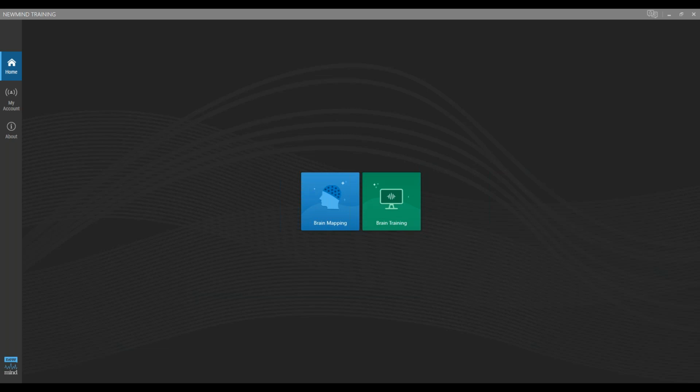Because I can't see that you're moving, but I see there's artifact here. And it was after a few sessions we discovered that for years and years it was kind of a nervous tick that they just kind of bit the inside of their lip. And once we kind of figured that out, the sessions improved greatly, as far as what I saw on the screen. Now, granted, that was years and years back when I was using BioExplorer.